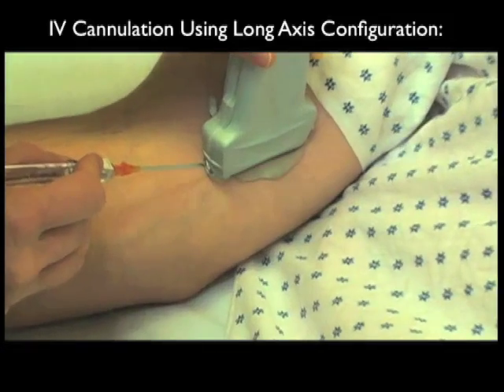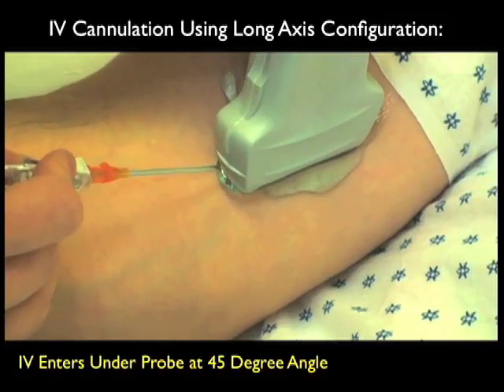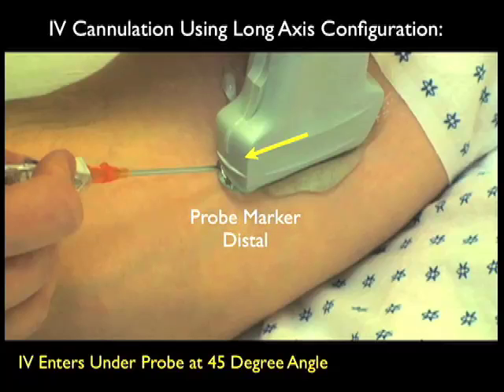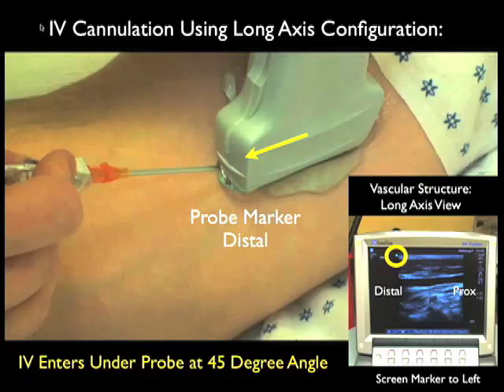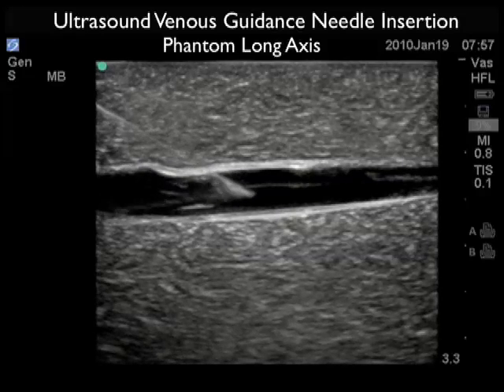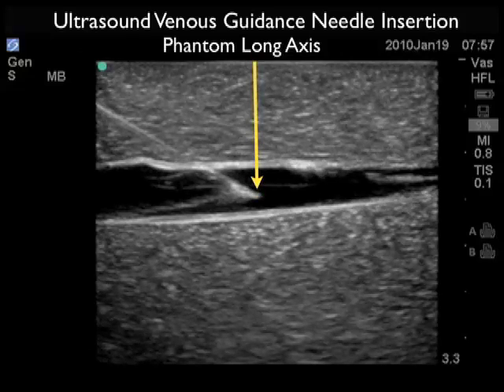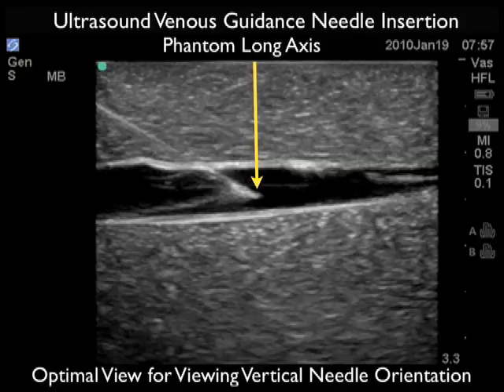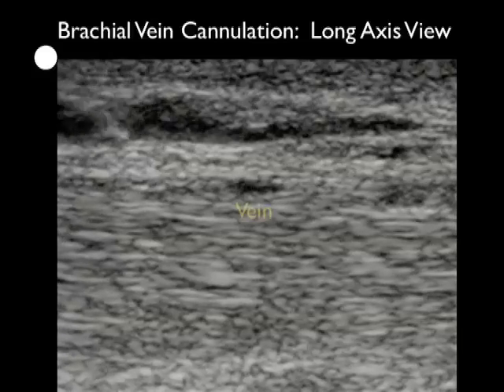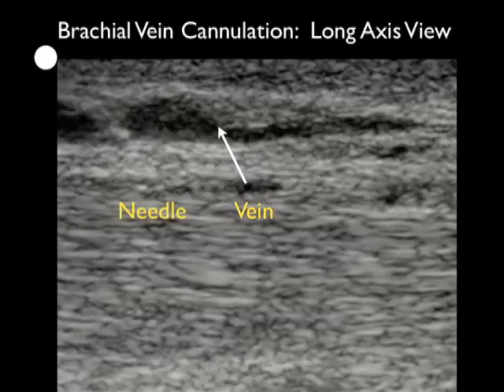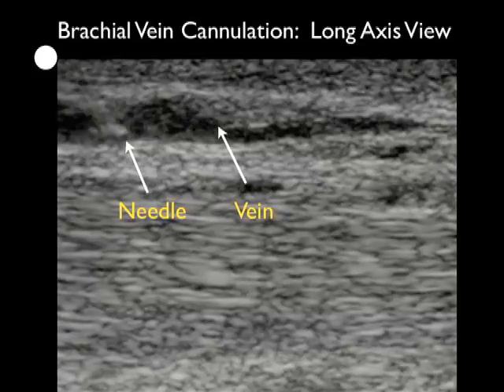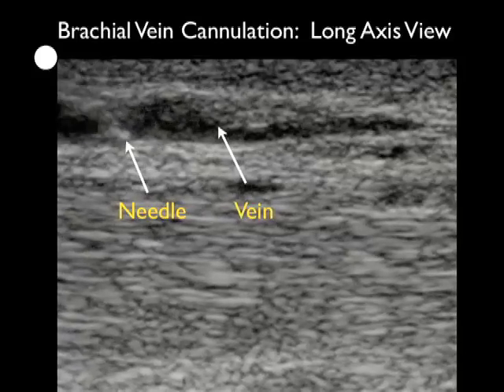We can also use the long axis configuration for cannulation of a deep arm IV. Optimally, you want to place the probe in the configuration of the vessel as it runs up and down the patient's arm. By tradition, we want the probe marker oriented distal so that the distal aspect lines up to the left of the ultrasound screen. Distal on screen will be to the left and proximal to the right. The IV then enters underneath the probe at a 45-degree angle. While the short axis gives information about side-to-side orientation, the long axis gives information about vertical needle depth. Here we see a needle coming from the left and permeating into the vein lumen, allowing accurate determination of the optimal depth of the needle in relation to the venous lumen.